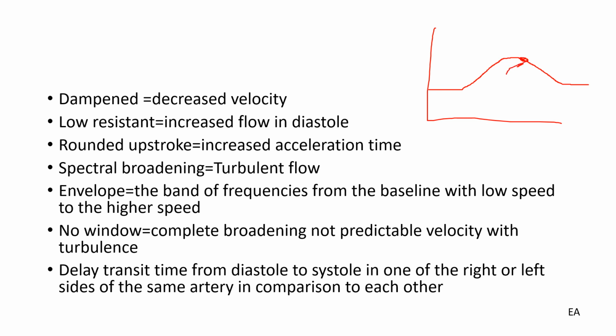So we have all here broadening. All these parts are white. No narrowing, no window, because of turbulence. We have here low velocities, here high velocities in the RBCs. The red blood cell here goes much faster than here, but we have all of them here, and even a little bit here because of turbulence.